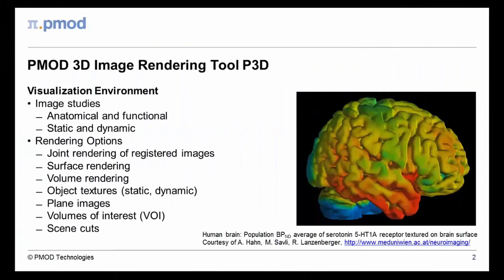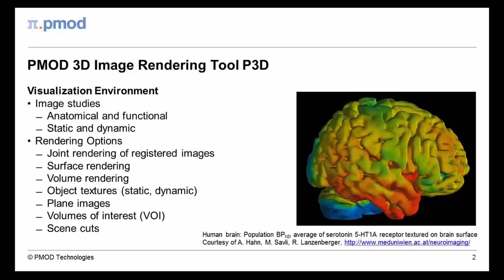PMOD's 3D image rendering tool offers a unique environment for visualizing information from anatomical and functional studies. It allows the construction of 3D scenes from any number of registered input series. Volume and surface rendering can readily be mixed in order to apply the most adequate technique for any data type.